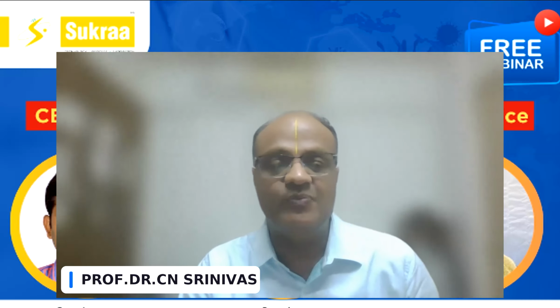Okay. So I have some things to share here. The American Society of Hematology, which is made up of clinical hematologists, has some information that the WBC has to be reported with both the percentages as well as the absolute numbers. So that becomes essential for them.